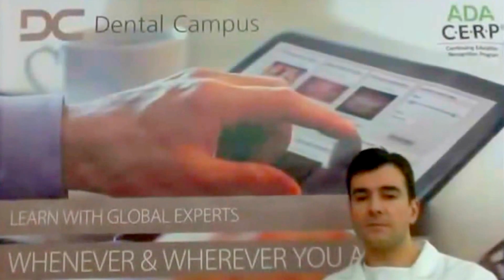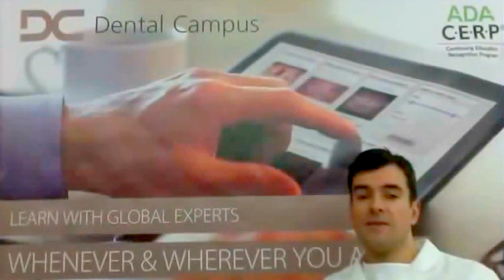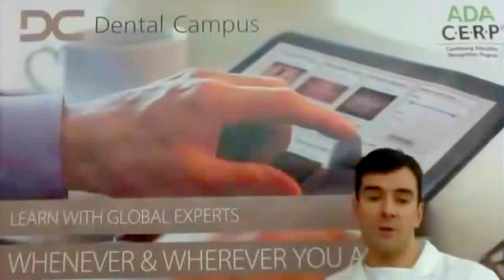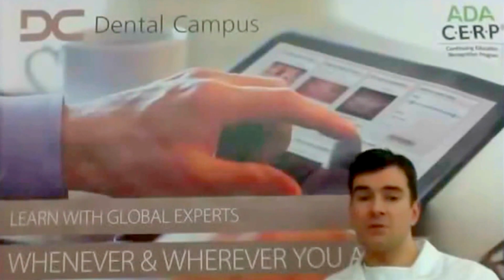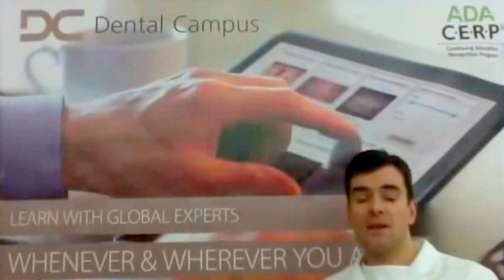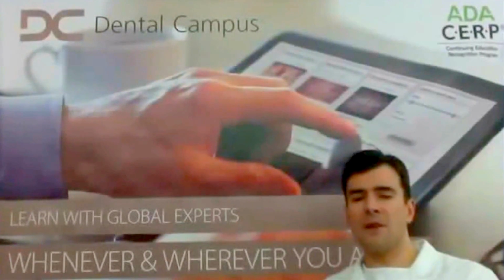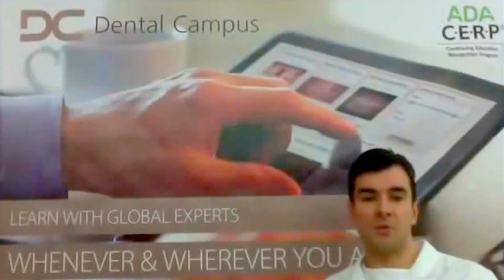If you place 2 implants or more, for example, 36 and 37, do you think that they need to be connected? I think they don't need to be connected. However, it makes sense. I always connect these 2 implants just due to the fact that the technical and the clinical procedure is easier. So it's easier to find the exact position of the implant, to place the 2 connected crowns, to construct a perfect interdental contact between 2 implants. It's very demanding. So of course, if you connect the implants, you don't have to think about this. It's just for clinical and technical reasons.